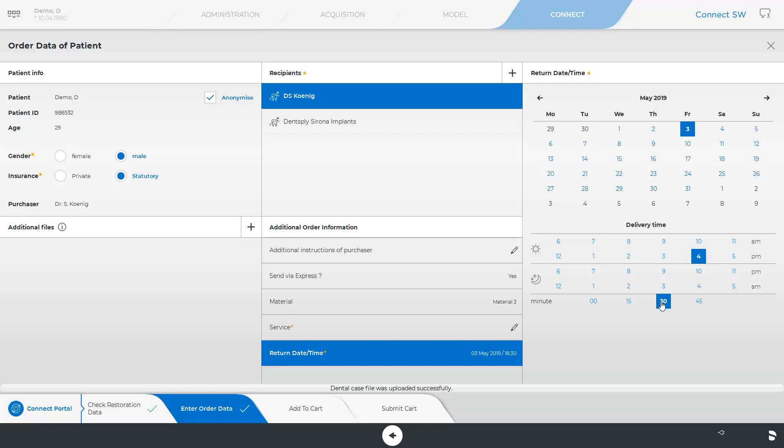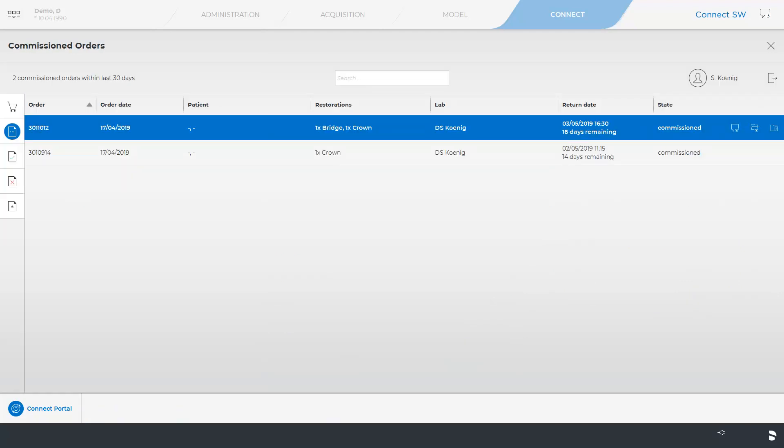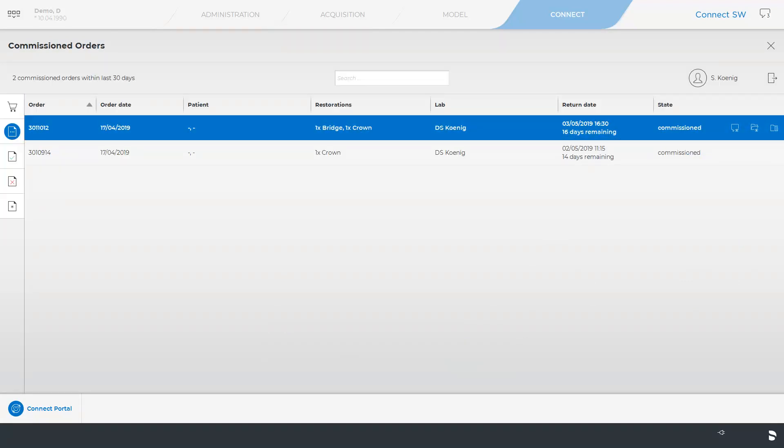After determining all obligatory fields, we can either add the order to the cart and collect further cases for transmission, or submit the cart directly. Now we have ensured that the patient case is commissioned.